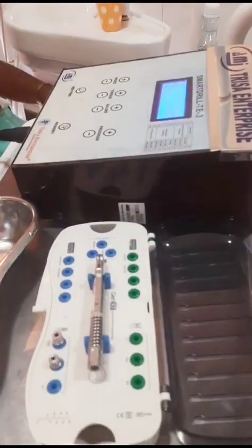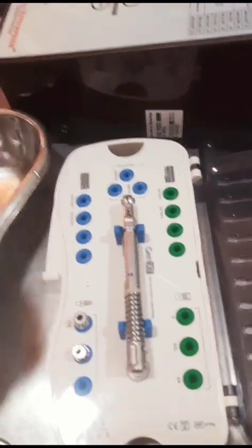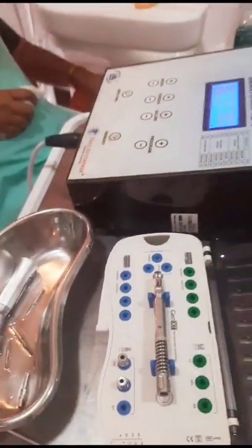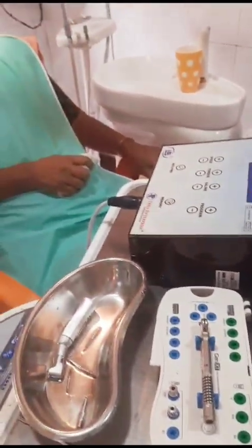The implant kit is very simple — you can see there are just a few screws here. We have just finished the surgery and cleanup is going on. We have only a few instruments, so it's not complicated.